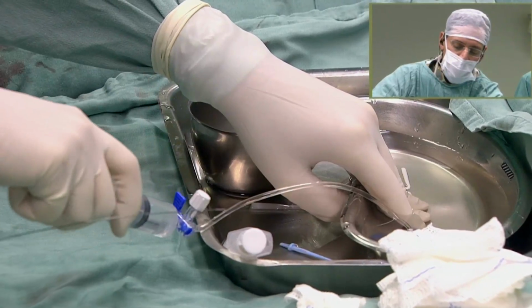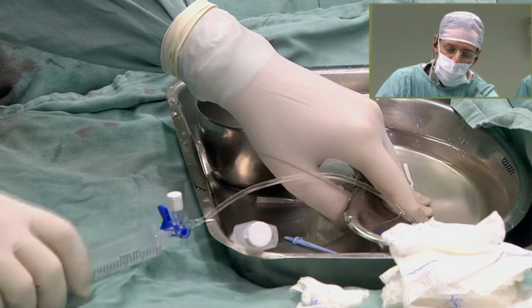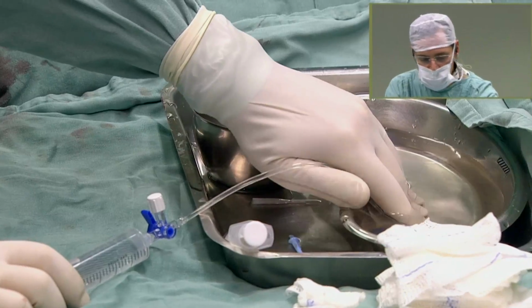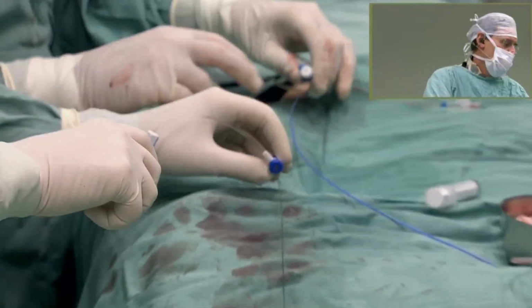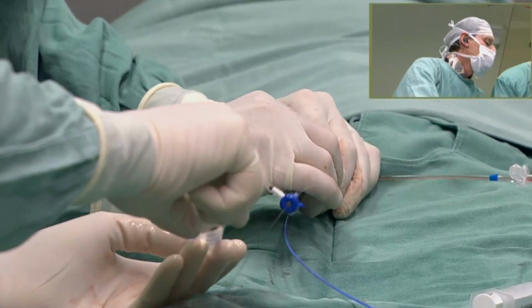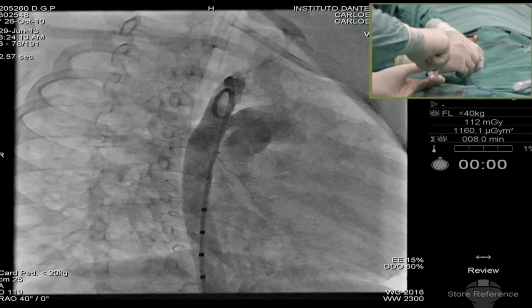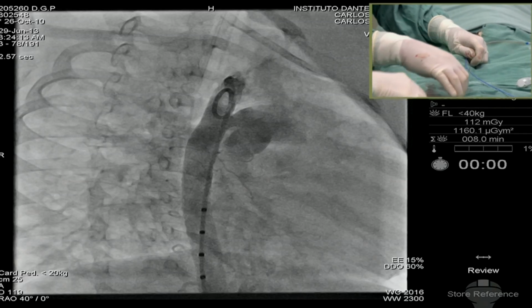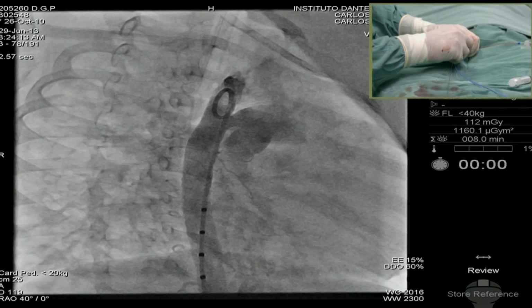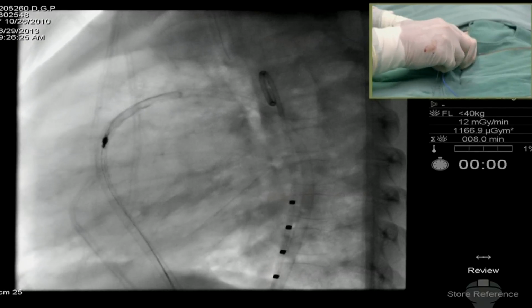That means if you take the large device and fit it in your fingers and put it together, with the distal disc reduced, you really have a smaller retention disc than you think. If you have the device inside the ductus, the retention disc is going to be smaller because there is no joint fixation point on the top.